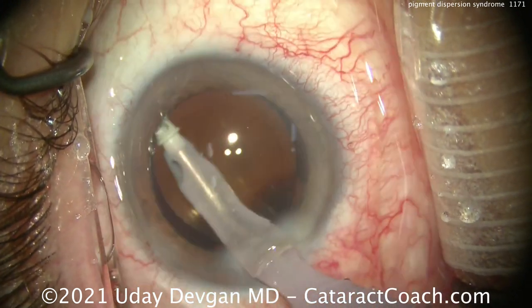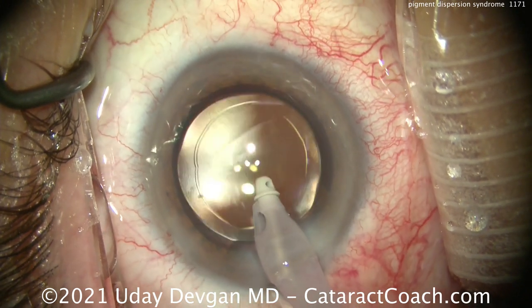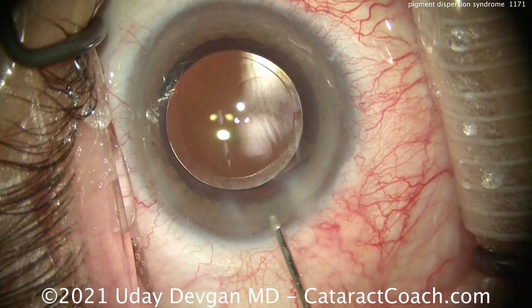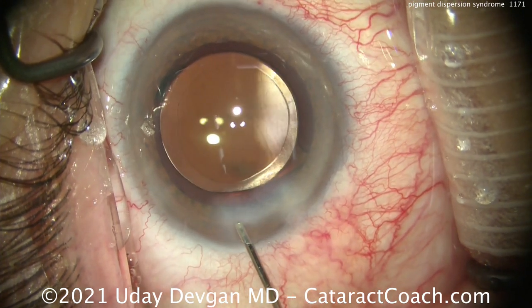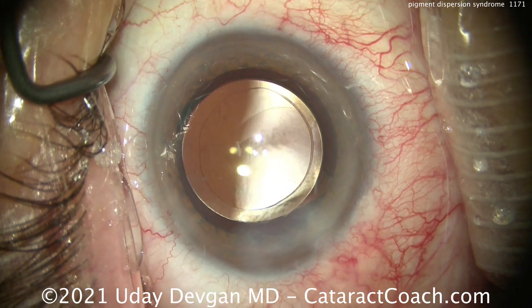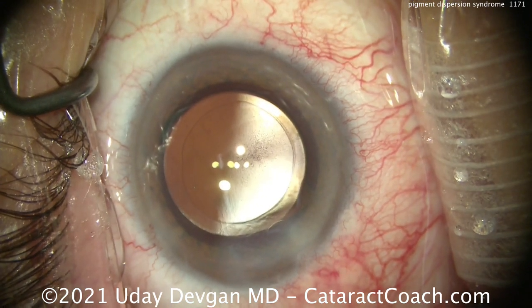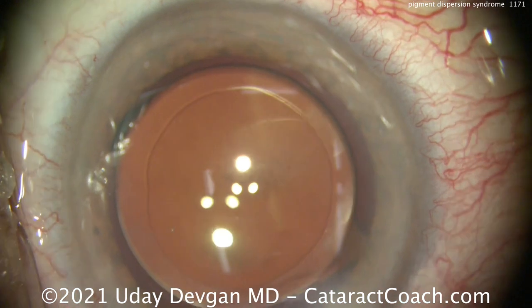We're also polishing up the capsule and washing out the angle. Of course, doing cataract surgery alone typically lowers eye pressure around 25%. So the straight cataract surgery has multiple benefits: one, it lowers eye pressure naturally; two, it fixes the cataract; and here we're also correcting the refractive error, making the vision much better so the patient subjectively will see far better than before.